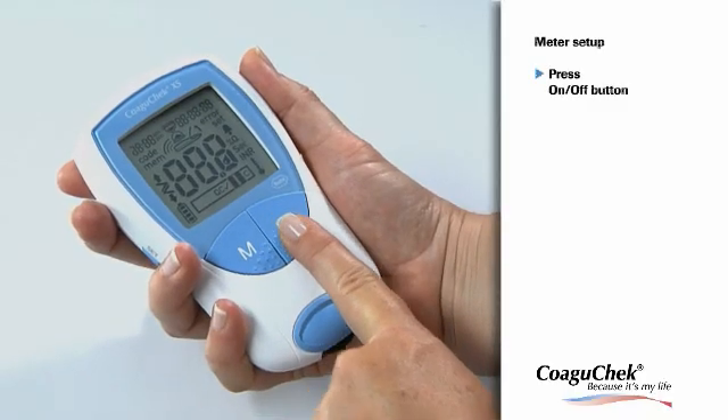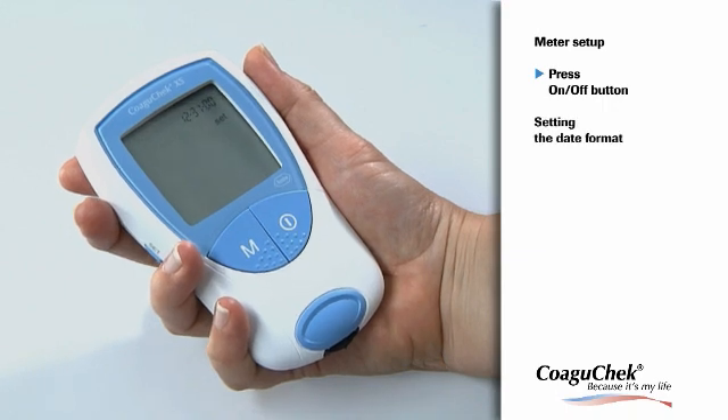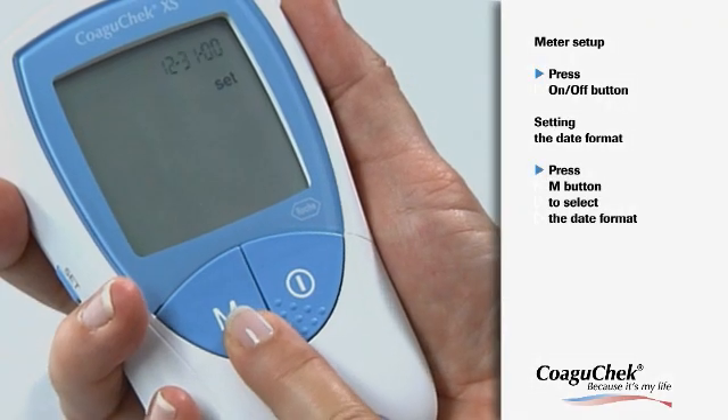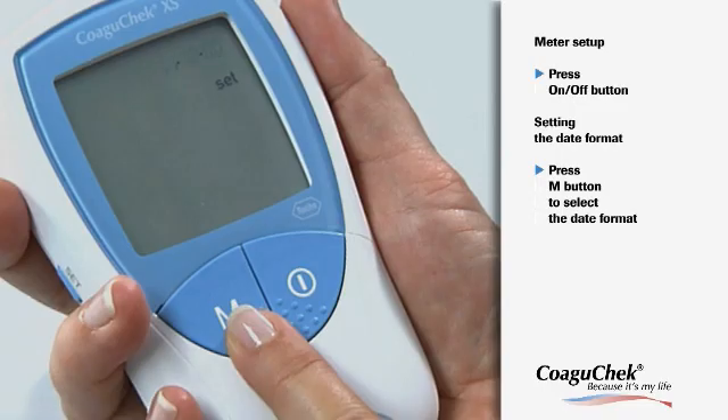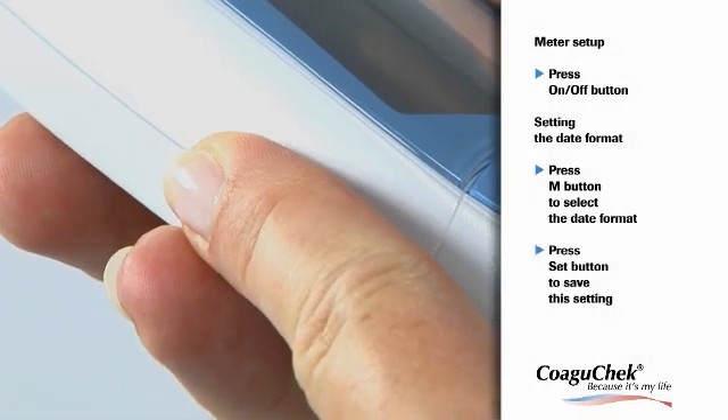Now you can turn on the meter by pressing the on/off button to enter the setup mode. First, select the date format. The preset is day, month, year. Press the M button to select the desired date format, and save your setting by pressing the Set button.